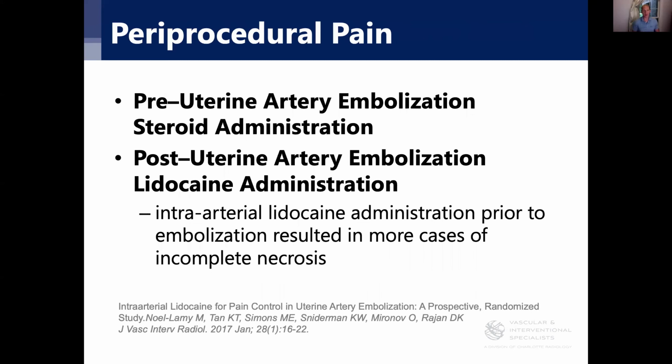And then other things that we do. Sometimes after we embolize, we administer lidocaine into the artery for the same reasons, to get rid of that post-ischemic pain. The key is that you administer the lidocaine after you do the embolization, because if you don't, you can cause spasm and you get incomplete treatment. I do this too. I find this is pretty easy to do. So, lidocaine into the artery after embolization and the hypogastric nerve block really control that post-ischemic pain. And then steroids too are something.